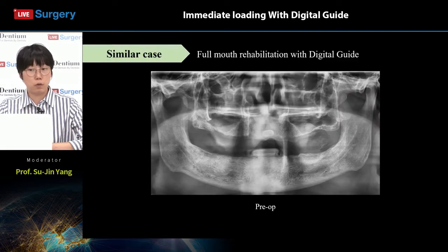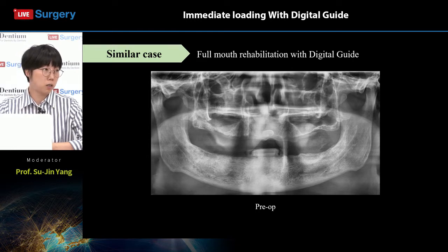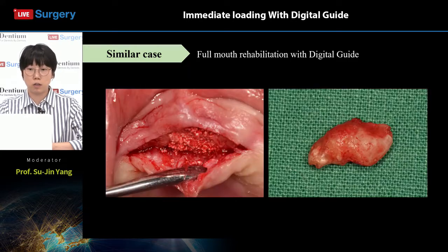Now, before we move on to the operation, we will go over a similar case so that we have a clear view of what today's case will look like. This is a full mouth rehabilitation case done by Dr. Kang-Hee Lee as well, using a digital guide. As you can see, there is a remaining supernumerary tooth on the central incisor area of the maxilla. So this tooth was extracted beforehand, and bone graft was done in the extraction site.